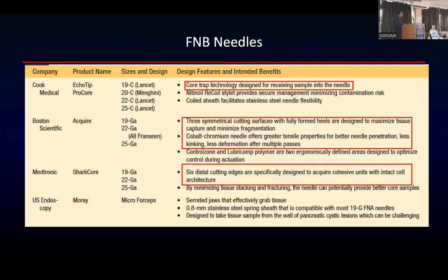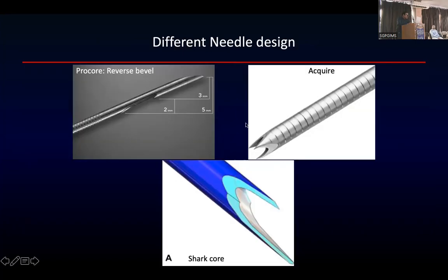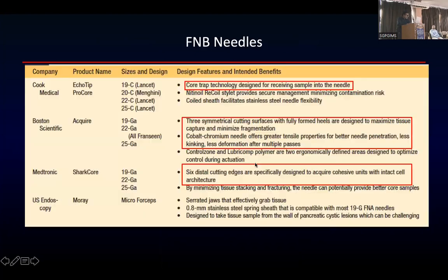If you see these needles, the Cook needle has CoreTrap technology designed for receiving the sample into the needle. The Boston needle, this is the one I showed you. You can see these cutting surfaces, 3 important cutting surfaces. Three symmetrical cutting surfaces with fully formed heels are designed to maximize tissue capture and minimize fragmentation. So all these designs are predominantly meant to get a bigger chunk of tissue.